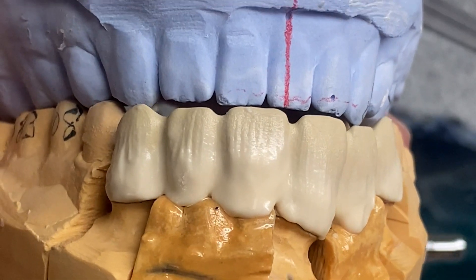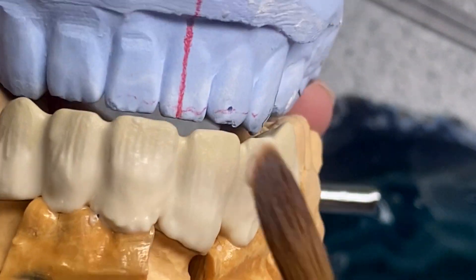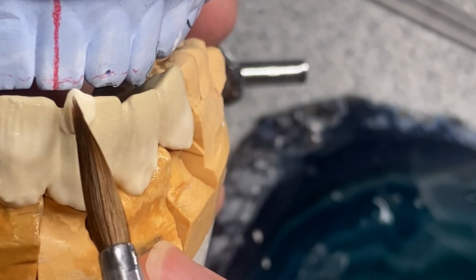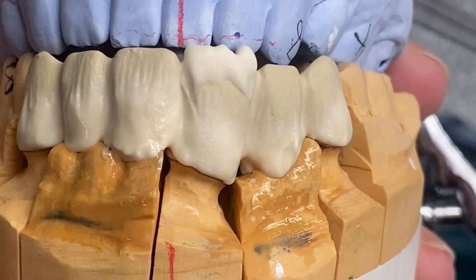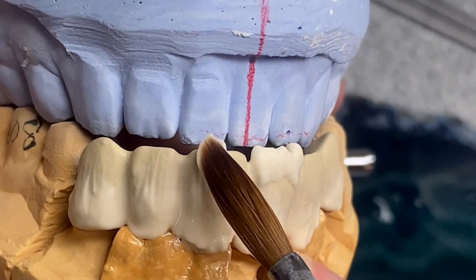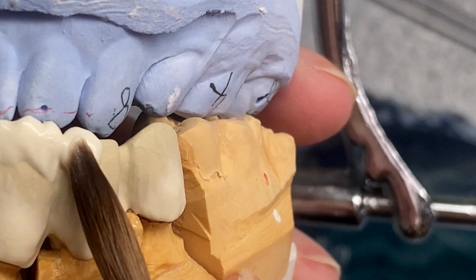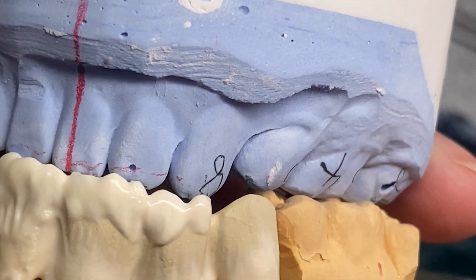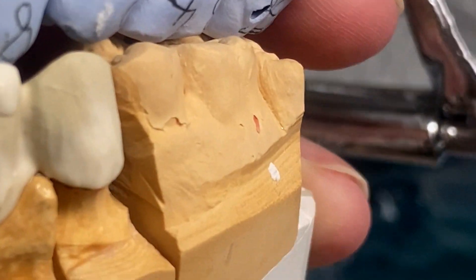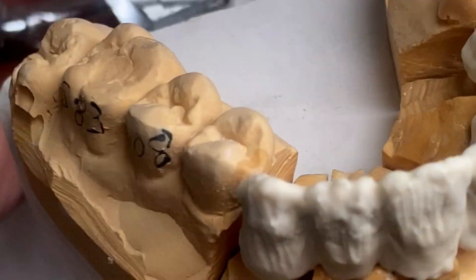Now I will apply fluorescent dentine 92 — it also looks opaque, kind of yellowish opaque — and it just goes to hide the edge. This is gonna be a simple style of build-up because it's an aesthetic case, but in a different way. When I have to fix the shape a lot, it's hard for me to think about the colors, translucency, and everything together in my head. I decided that today's build is gonna be pretty simple.